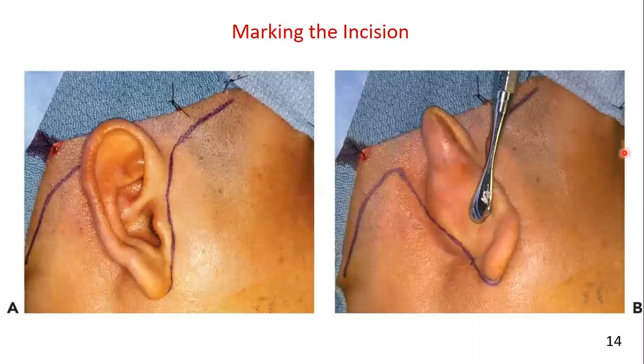The incision begins approximately 1.5 to 2 centimeters superior to the zygomatic arch, just posterior to the anterior extent of the hairline. Now, the incision can be extended forward onto the hairline for better retraction. The incision then curves posteriorly and inferiorly, blending into the preauricular incision in the natural crease anterior to the pinna, the same position as in the preauricular approach to the temporomandibular joint. The incision extends to the posterior aspect of the ear before sweeping down the hairline.